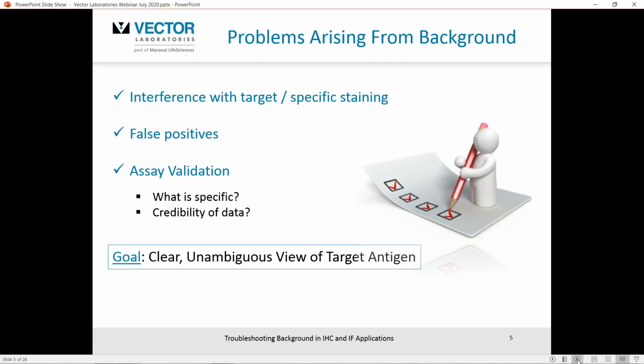So what are some of the problems arising from background in these applications? Certainly interference with the target or the specific staining you're trying to identify. There could be a lot of confusion with the antigen expression. This leads to false positives. Certainly there may be cells identified that are not supposed to be positive, different cells, different cell types, indeed different cell compartments may stain. Potentially if you're looking for a nuclear antigen, there may also be staining in the cytosolic area. So what this does is raise questions about your assay validation, raises questions about what is specific, and it does undermine the credibility of your data, certainly for publication purposes or anything beyond that. The goal in these applications for immunohistochemistry and immunofluorescence is a clear, unambiguous view of the target antigen you're looking for.